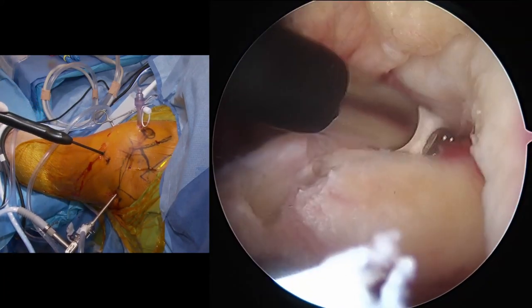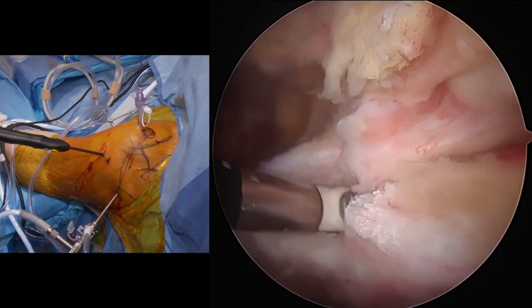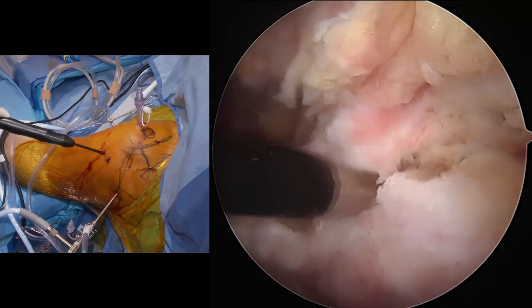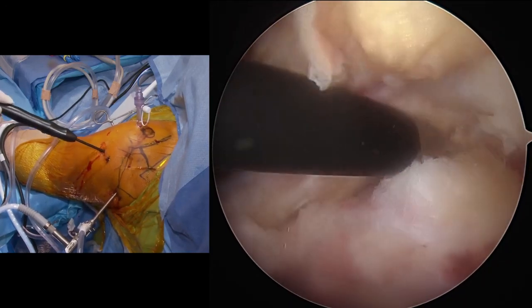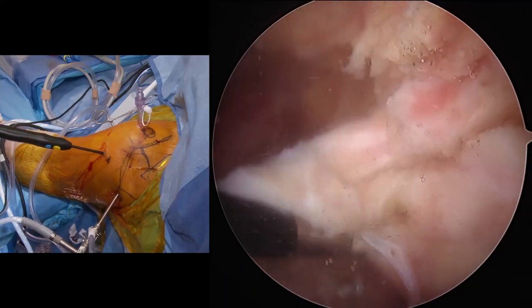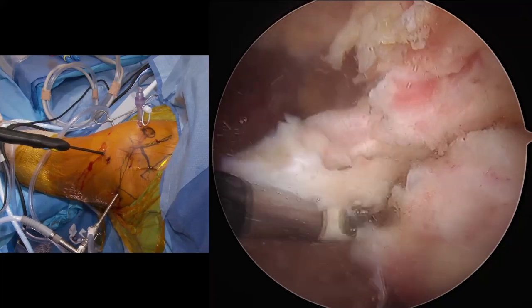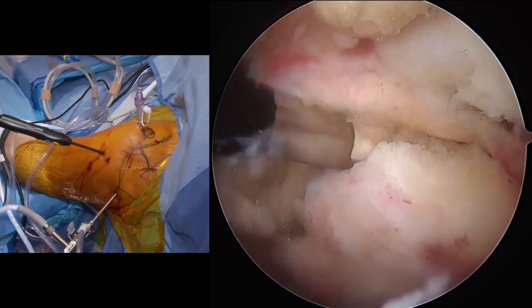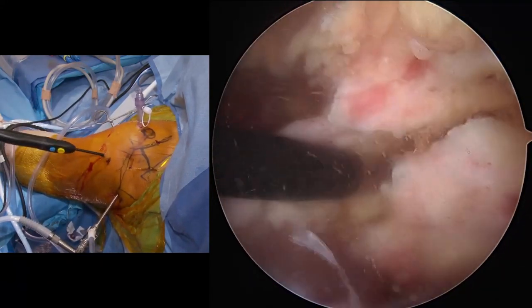We're going to have to release a little bit of this capsule to get this mobile. Yep, he likes to jump there. We're just close to the cuff. He's getting some conduction of that all the way down into his biceps.